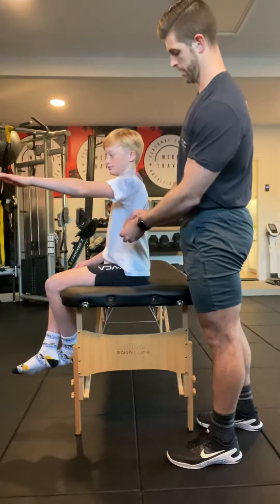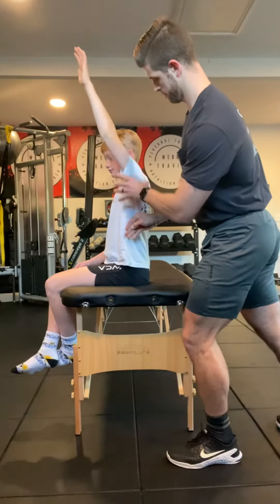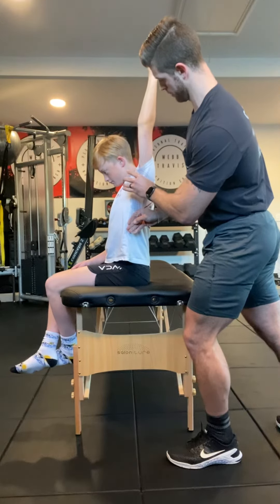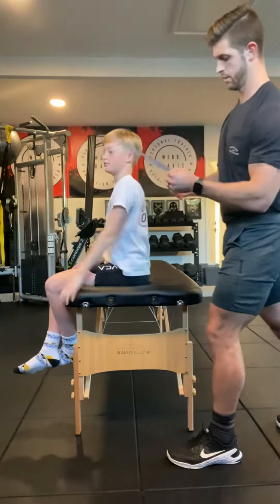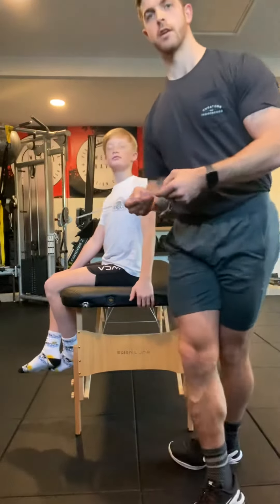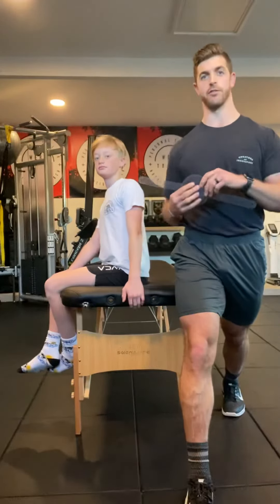When you're ready, go all the way — keep going, keep going, keep going. Right there, good. Our client has a range of motion of 183 degrees. The normal range of motion is between 150 to 180.